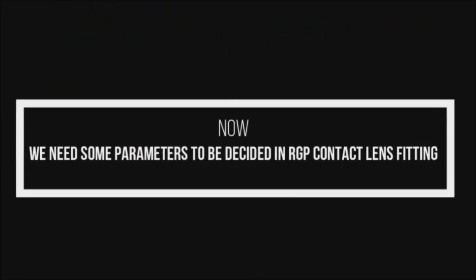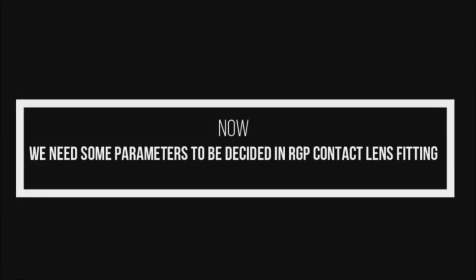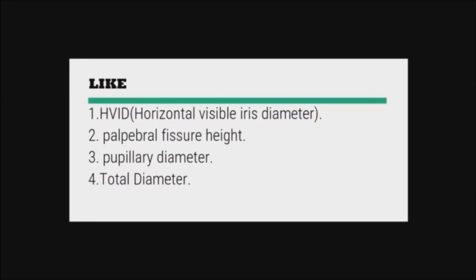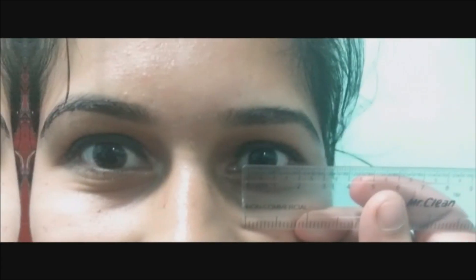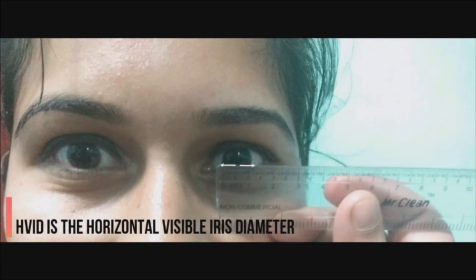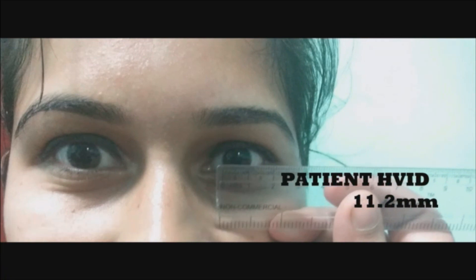Next, some parameters to be considered in RGP fitting: HVID, palpebral fissure height, pupillary diameter, and total diameter. Now measuring the HVID, which is the horizontal visible iris diameter. The patient's HVID is found to be 11.2 mm.